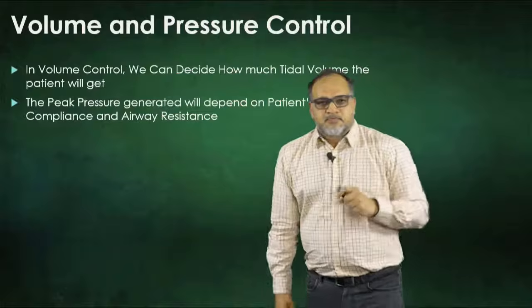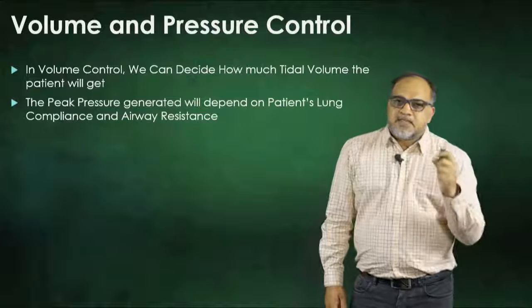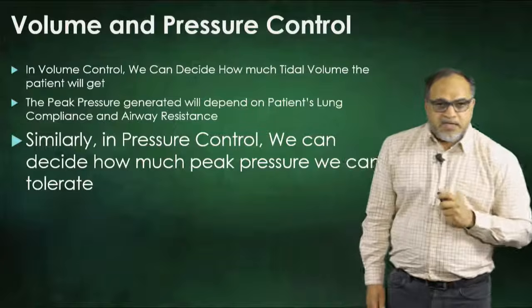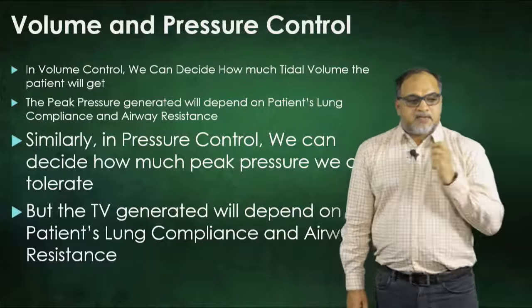So in volume control, you control tidal volume and pressure is dependent on the patient's lung compliance and airway resistance. In pressure control, we can decide how much peak pressure we can tolerate, but the tidal volume generated will depend on the patient's lung compliance and airway resistance.